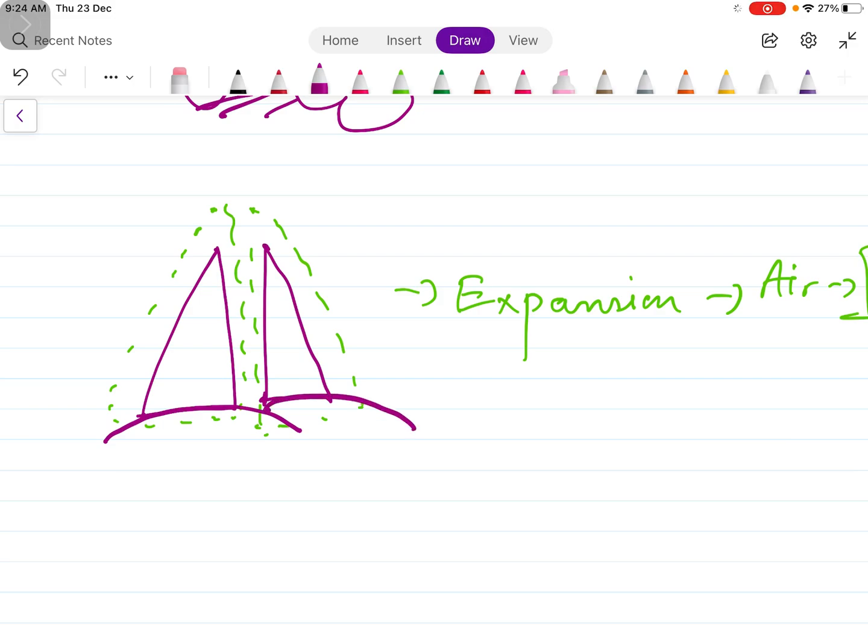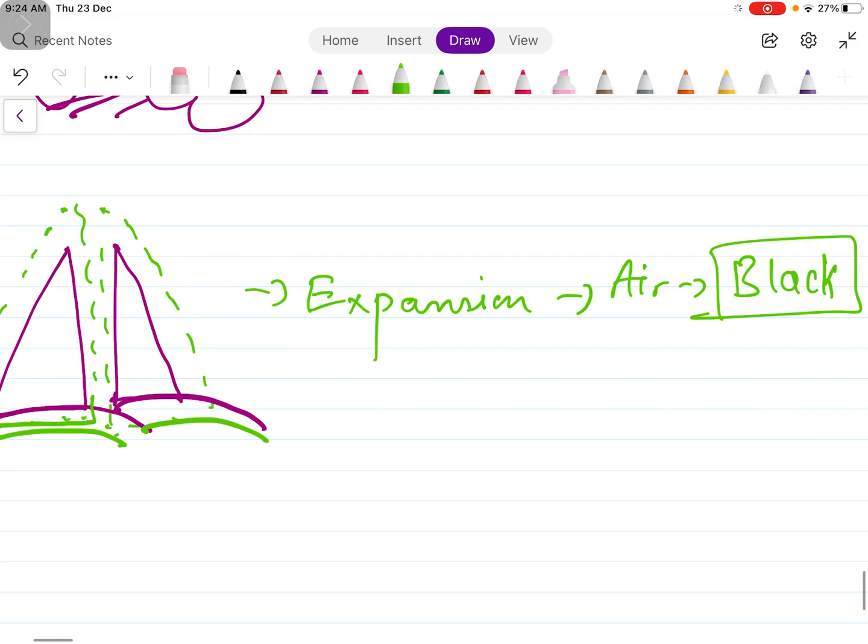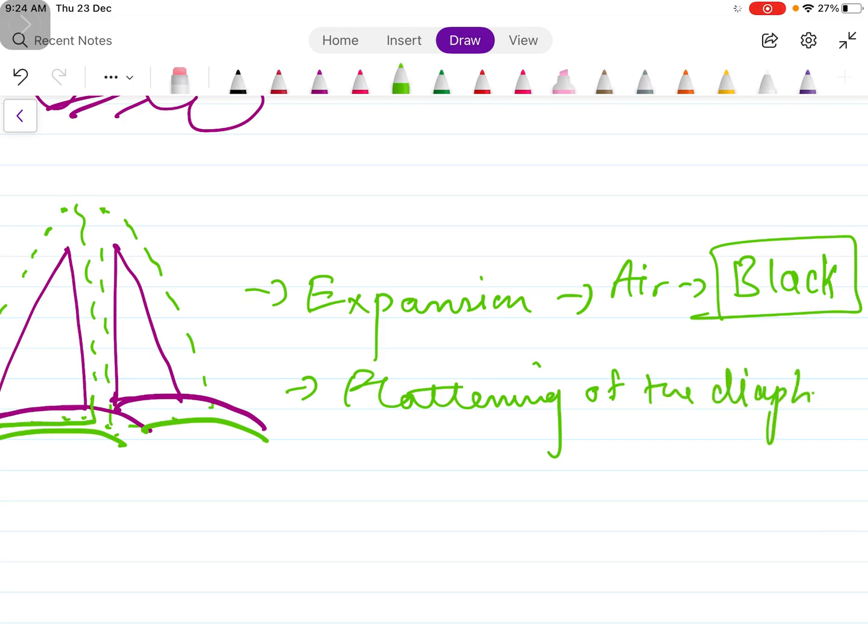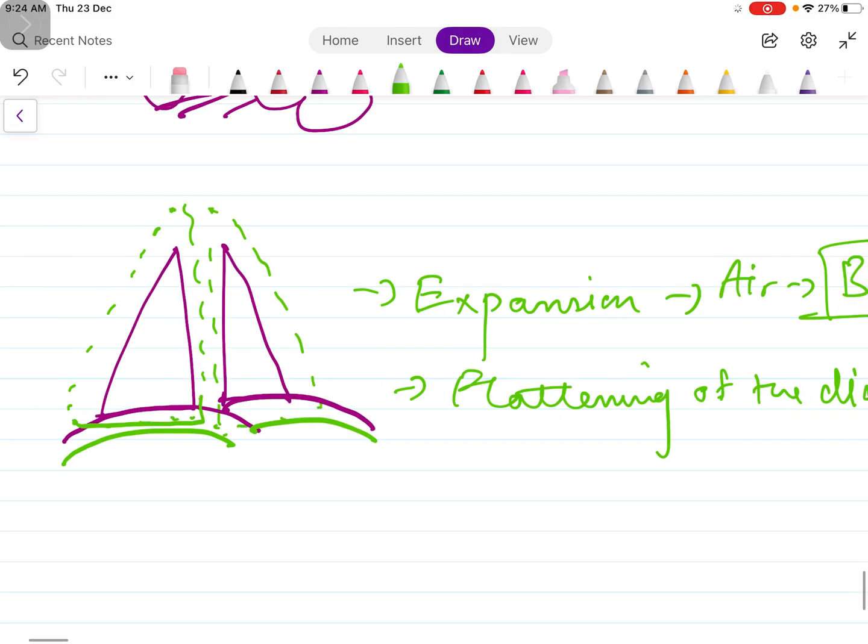Now there is a diaphragm on both sides, but if the lung is expanded, you can see that the lower border comes down, so this diaphragm will also be pushed down. So this will lead to flattening of the diaphragm.